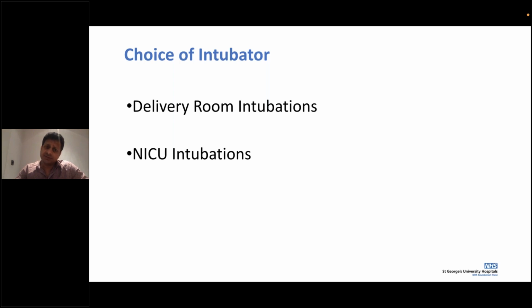So there is a general shift from just intubating and ventilating, and intubations are usually reserved for the baby who absolutely needs it, and that's why you may not necessarily get as many opportunities for intubation within the delivery room, within the delivery suite, or in theatre, for example. And also, it's a thought process around, if intubation is needed in the delivery room, your timing from the time of birth to intubating or securing an airway is absolutely key.